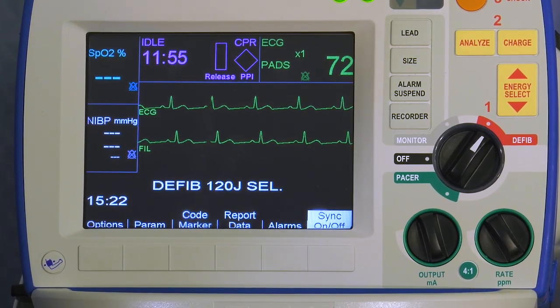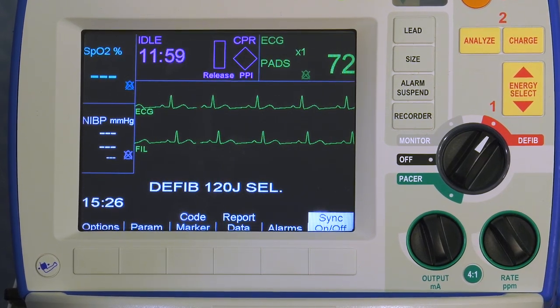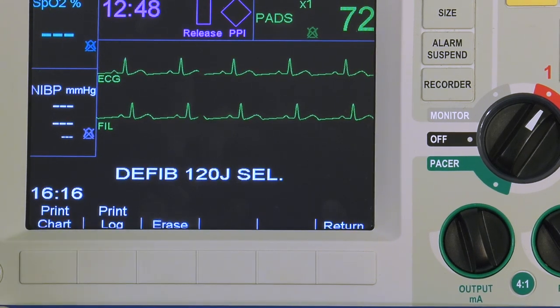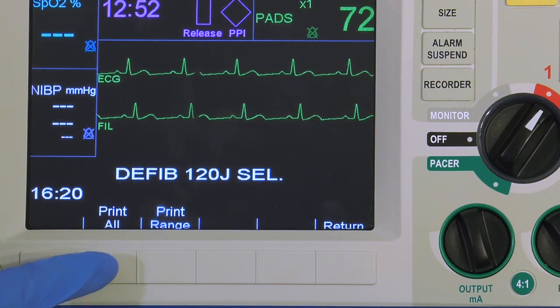The print chart summary report provides ECG strips for a specific time or for all activated events. To print a print chart summary report for all events, press the report data soft key, then press print chart, then press print all.